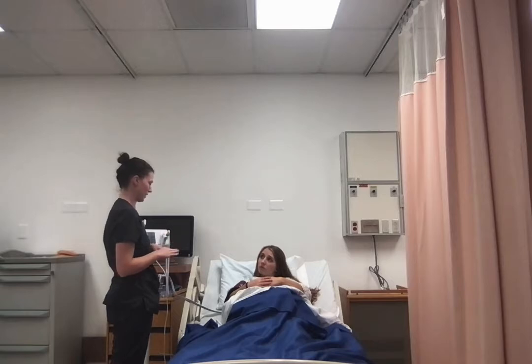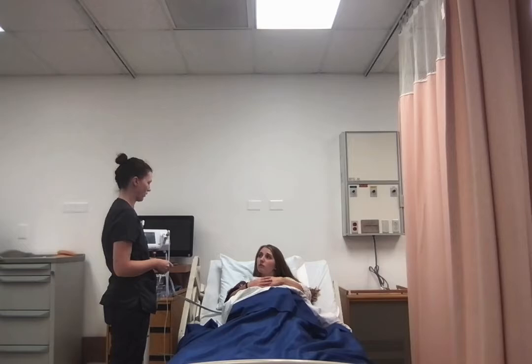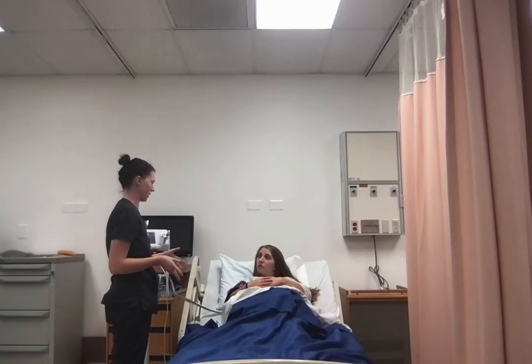Your baby's heart rate has moderate variability and is absent of decels, and it's averaging about 160, which is also really great. So all of that's normal? All of that is normal, yes. Okay. I'm going to go get a couple of things, and then I can come back and we can go over some of those laboring positions as well. Okay. Can I get you anything else while I'm out of the room?